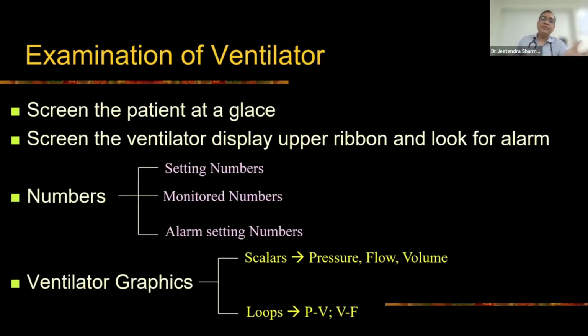This is like we are having an examination of the patient. Similarly, in the ICU, we must have a predefined way or checklist for how to examine the ventilator. So this is my proposal. You can take a snapshot of this slide, and if you understand that, it's very good. Even if you want to make certain changes according to you, please do that. But every day follow the same pattern of examination of the patient and examination of the ventilator.